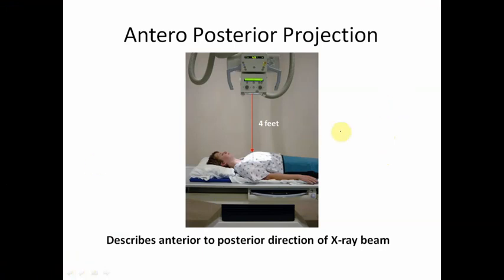See, now the patient is lying down here. You can make out the patient is lying down in supine positioning. The mid sagittal line is dividing right and left of the patient. So this is the table, for example. If the patient is lying down like this, this is the mid sagittal line, which is dividing the right and the left. Now if this line is perpendicular to the table, we call it mid sagittal line should be perpendicular.